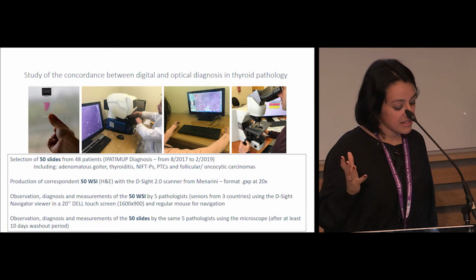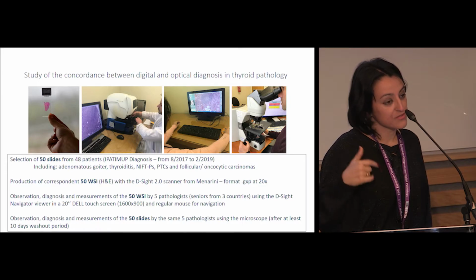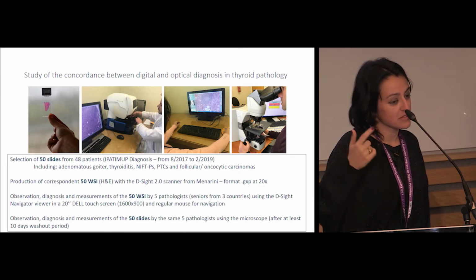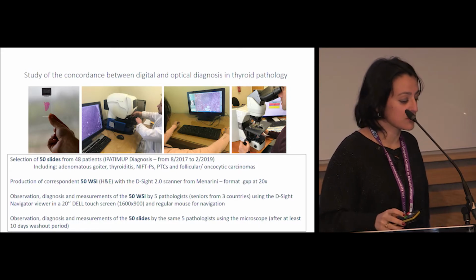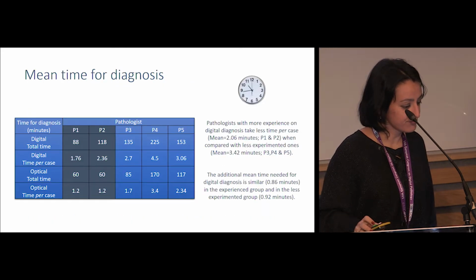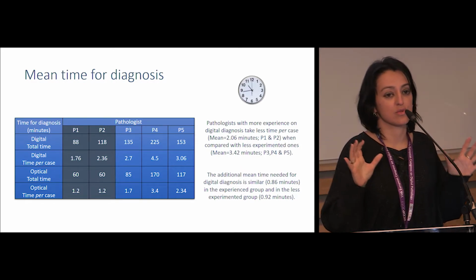And then, at least 10 days after, they observed again, but this time using the microscope. First time using digital, second time using microscope. So the other way around as it used to be done. So what we realized concerning time is that we have two situations.